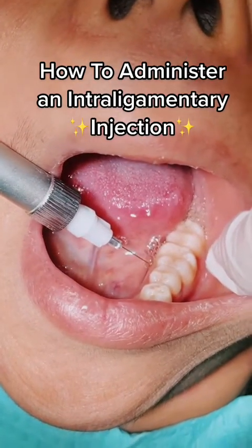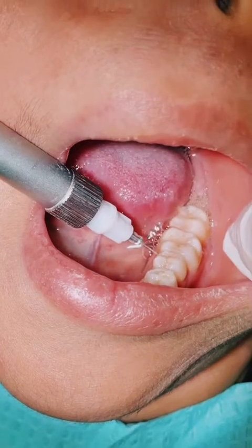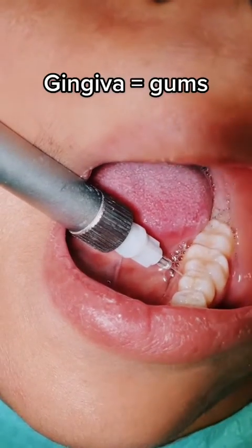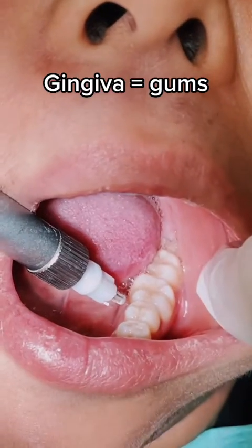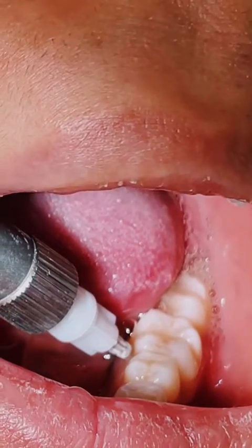Open as wide as you can and just drop the anesthetic without having to put anything there. The gingiva gets blanched a little bit and then you start putting it in there slowly. When they start feeling it, just go slowly — really slow.